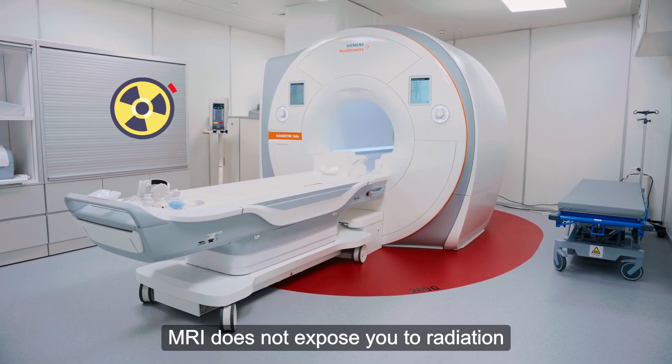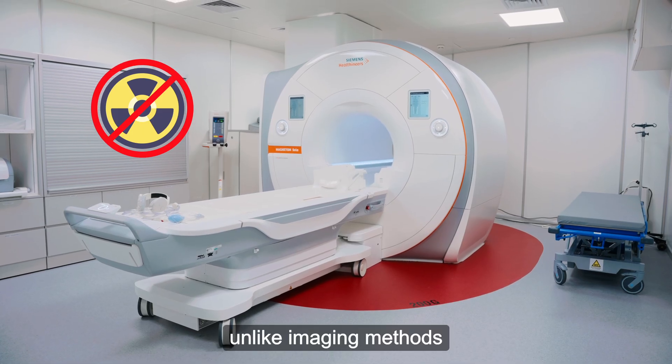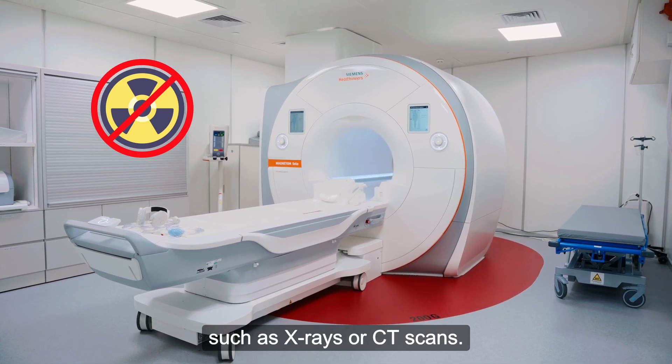MRI does not expose you to radiation, unlike imaging methods such as x-rays or CT scans.